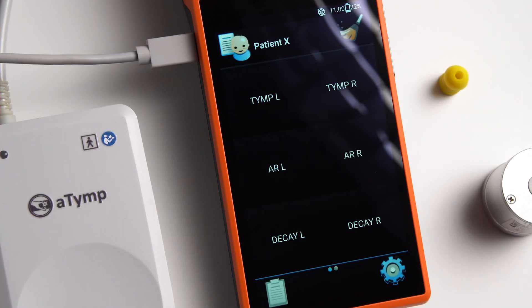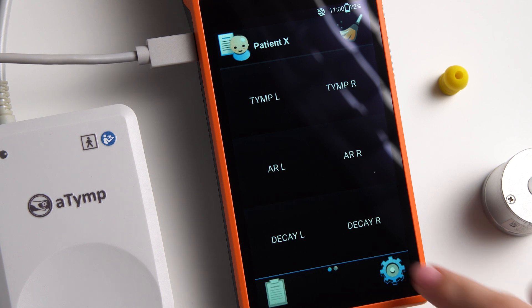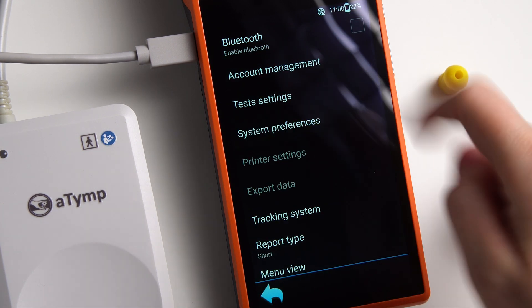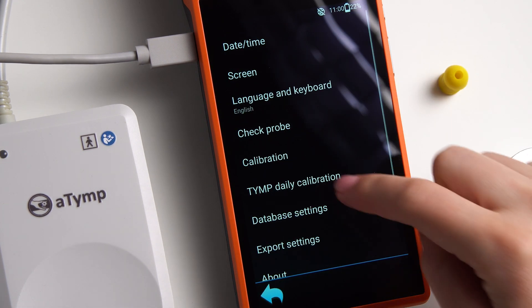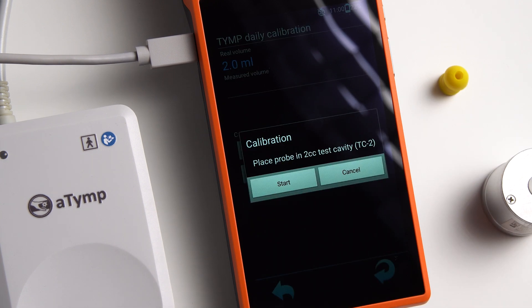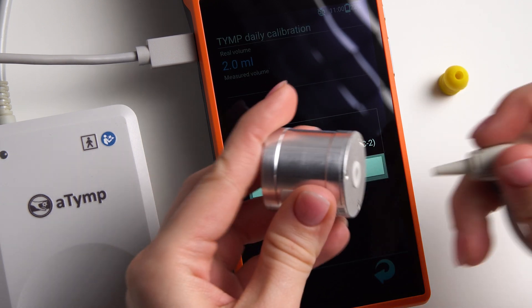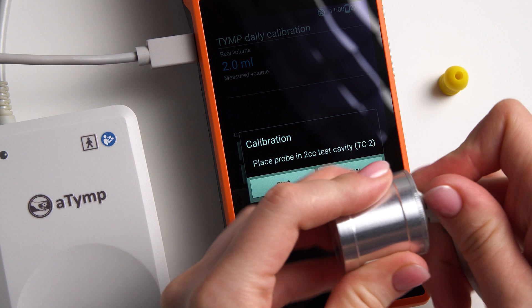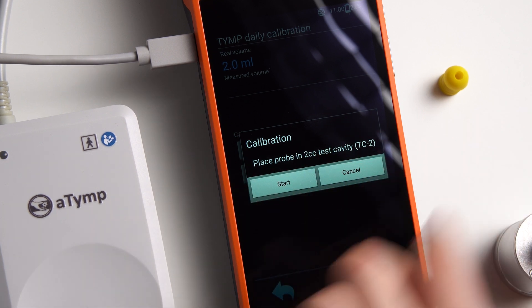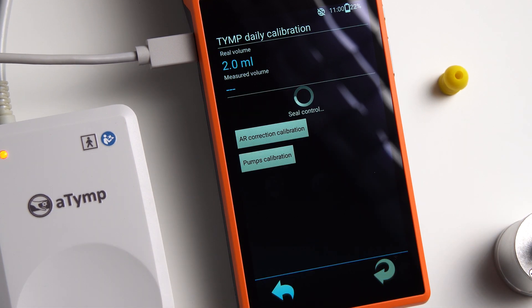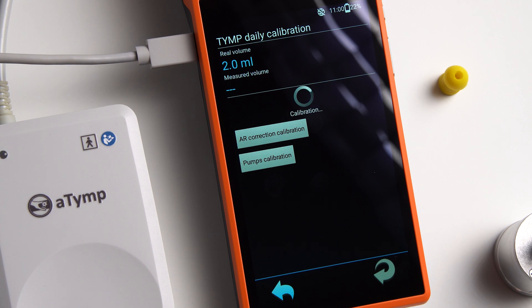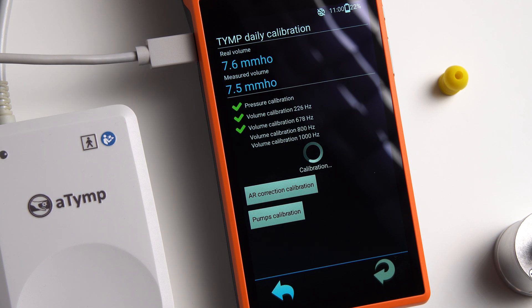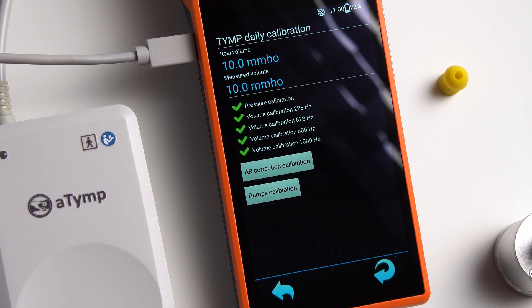Before starting the working day, we perform daily calibration of the device. To do this, go to the settings, press system preferences, daily calibration, take the probe, insert the probe tip firmly into the test cavity, then press the start button. Calibration is completed. You can start working.